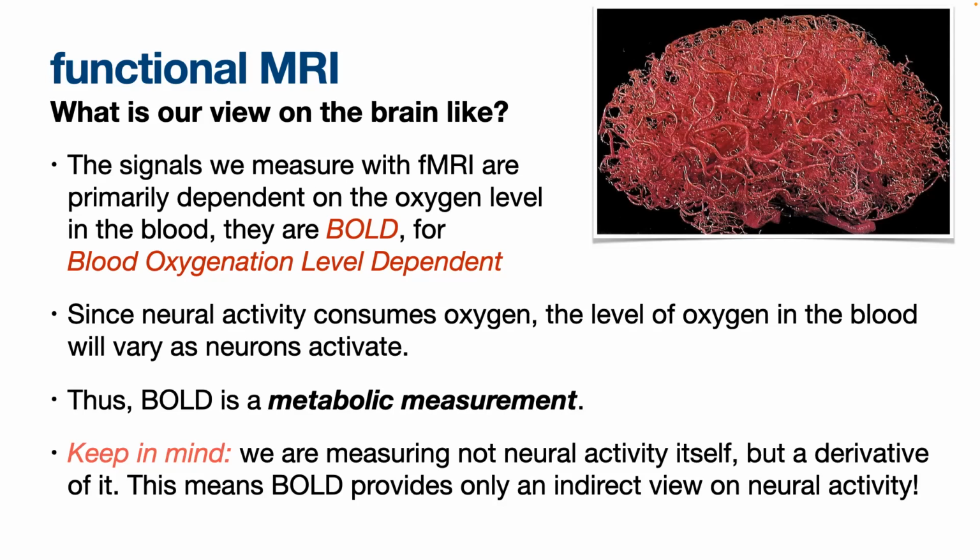And this is just one of the things where it's important to realize that you may think that you're looking at something very specific, but you're seeing it through different lenses. So in this case, what you're always looking at in terms of fMRI results is this blood-soaked lens. Everything that you're seeing is through a blood response. This is also what limits our temporal precision, for example.